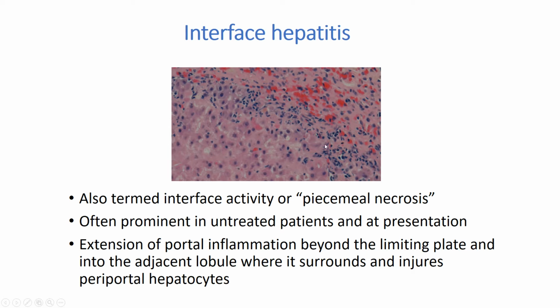So interface hepatitis is also termed interface activity, or the old term is piecemeal necrosis. It's like chewing up individual hepatocytes at the periphery of the portal tract. And this is often prominent in untreated patients and at presentation, both.